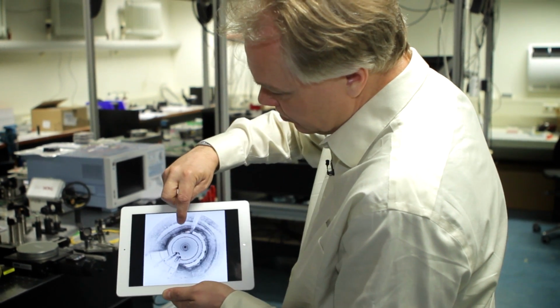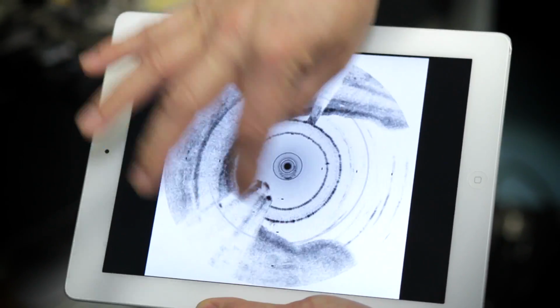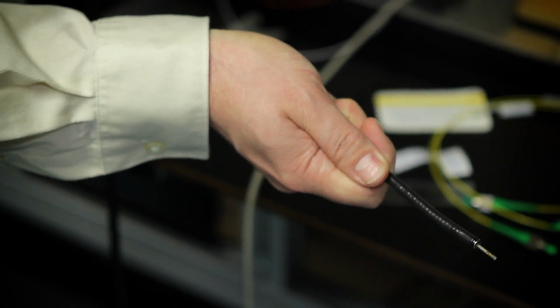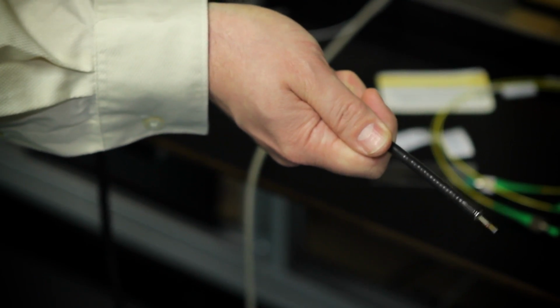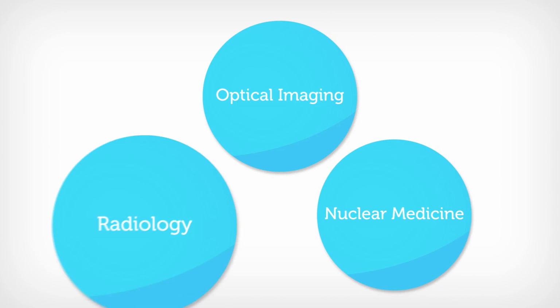But the thing that's of real interest is the epithelial layer there and the darker layer there and what's beneath that. And that is where tumors develop. So by going with this technique into the human body, we can look for these abnormal areas and see if we can find tumors.